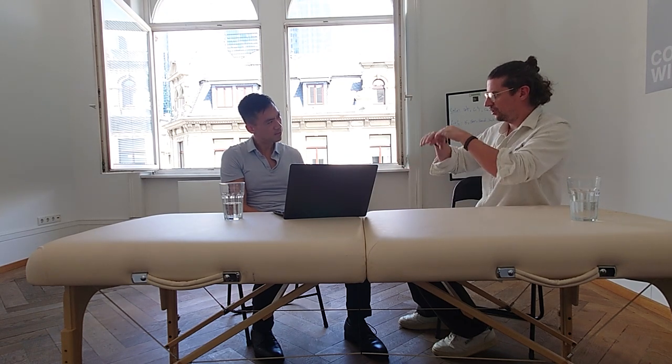For example, you have your left leg, which is not operated on in the knee. This is the guideline where you have to go. And then you have the data from your right leg, and you start pretty low, which is normal after surgery. But then you can monitor over time whether you are coming close to your left side. So this is the easiest way.